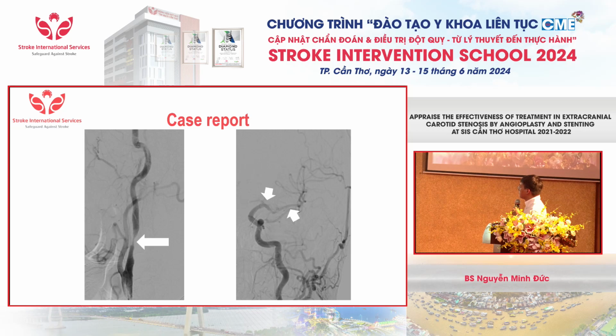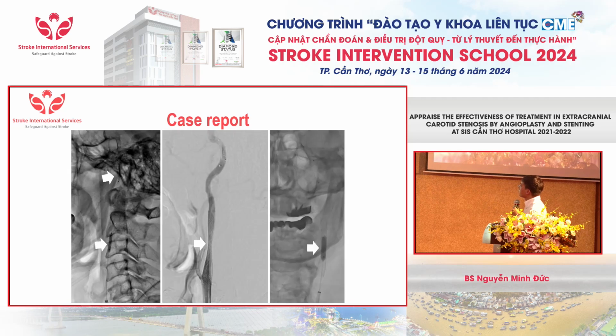The angiogram confirmed severe stenosis of the LICA, and maybe a clot causing occlusion of the MCA.